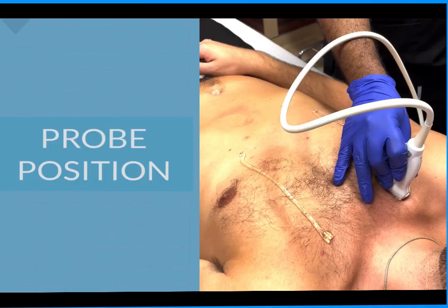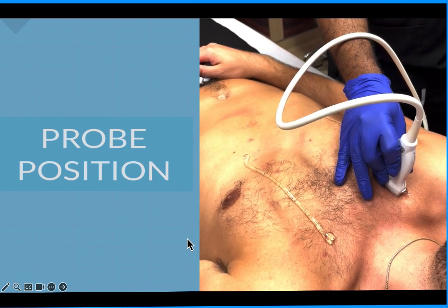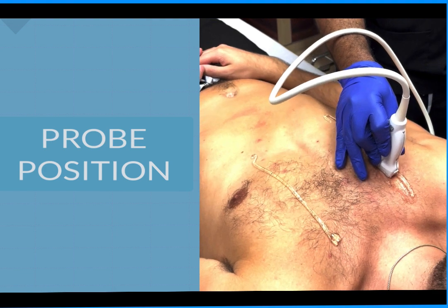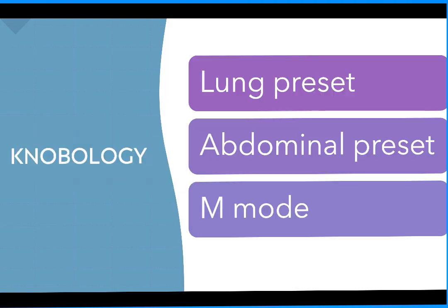This is just a video showing how you would position your hand. And right here is the probe indicator. So the indicator is towards the patient's head. The reason why I'm putting my fingers here is just to stabilize the probe, because you're going to be looking at your ultrasound monitor while you're slowly going down. And you're just literally sliding slowly down, and then you're going to turn all the way and slide back up. Easy, right?